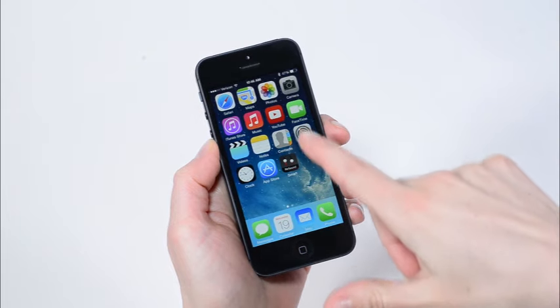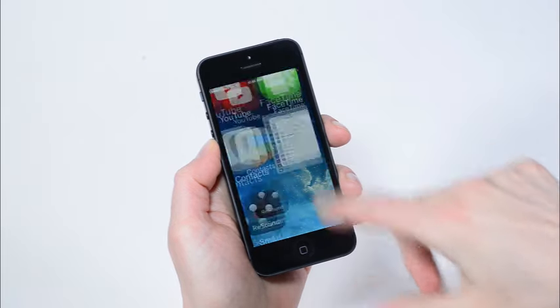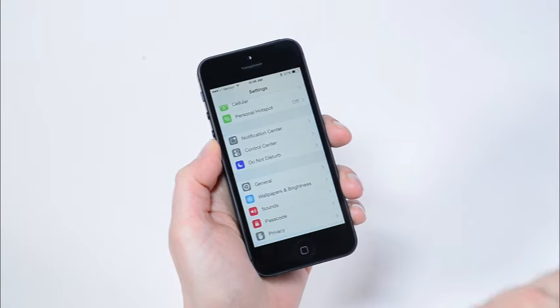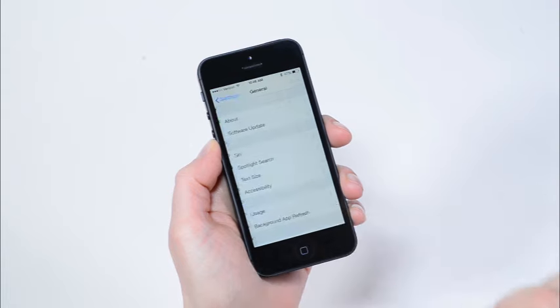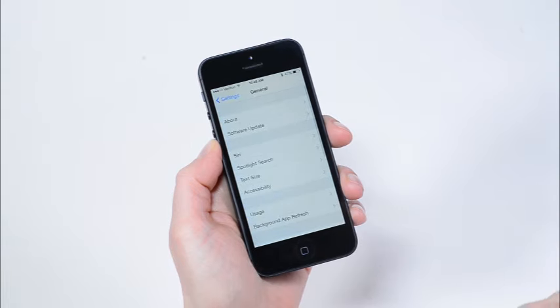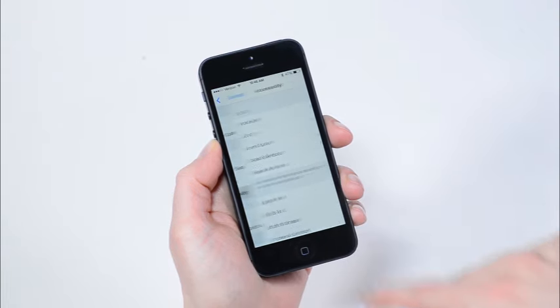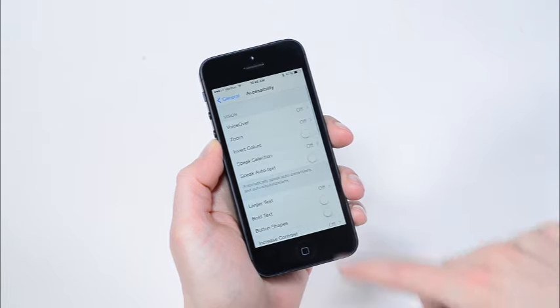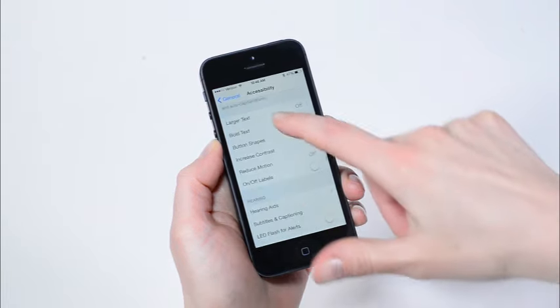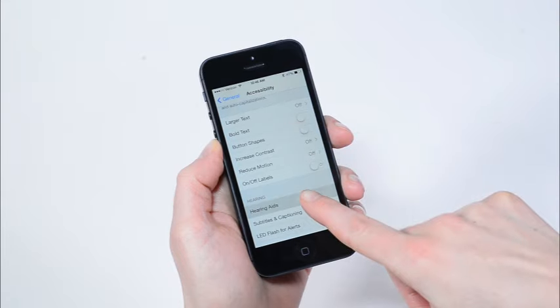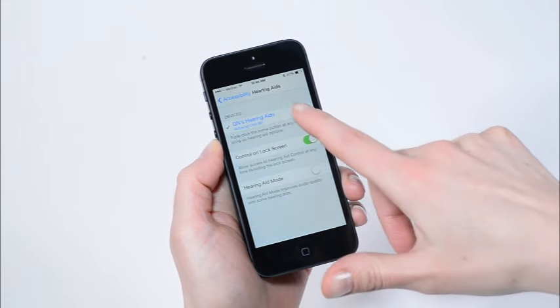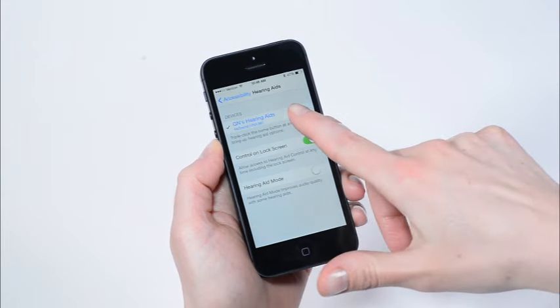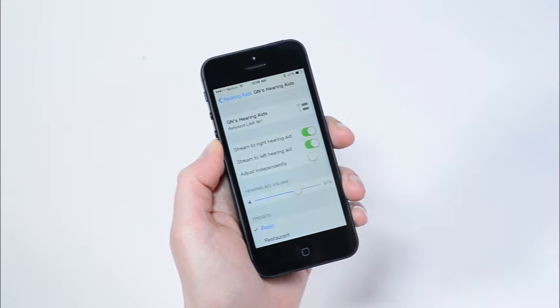To start, just tap Settings, then tap General, Accessibility, Hearing Aids, and finally tap the i icon next to the name of the connected hearing aids.